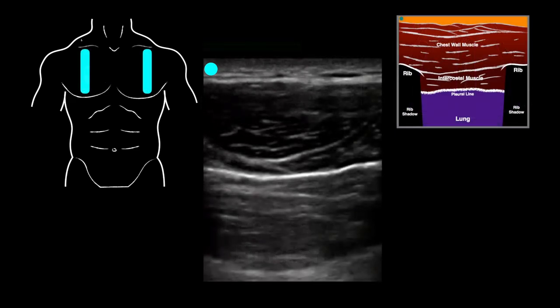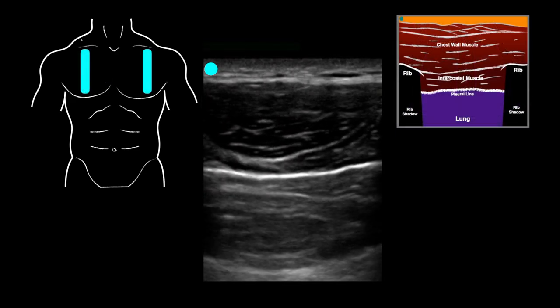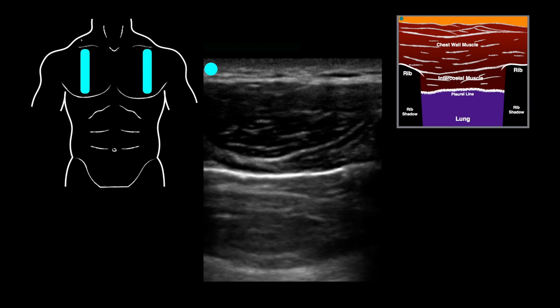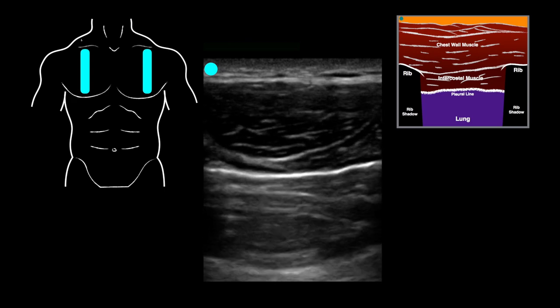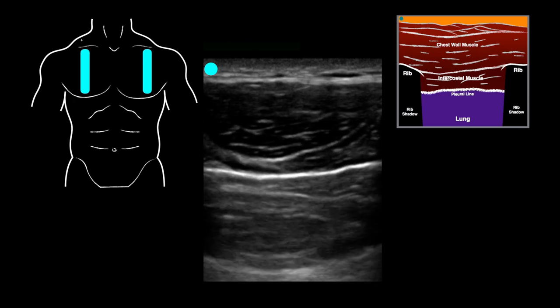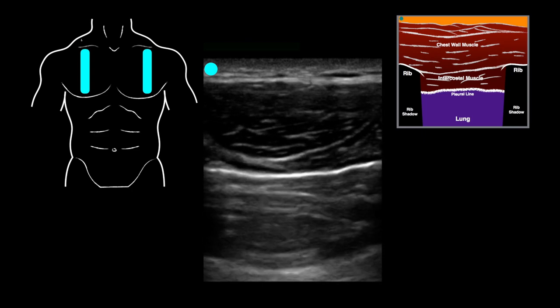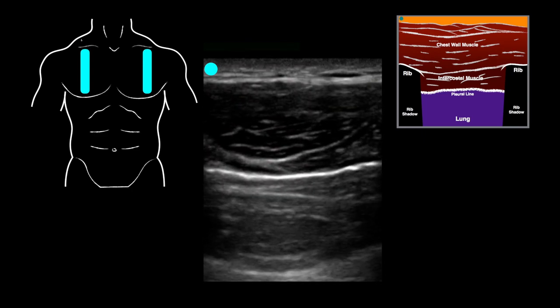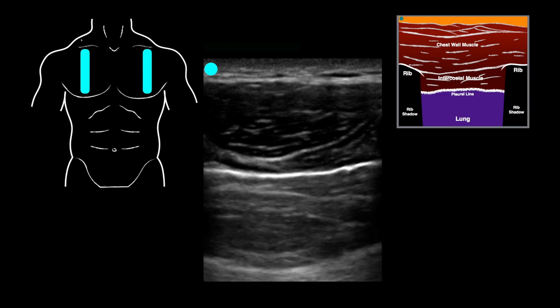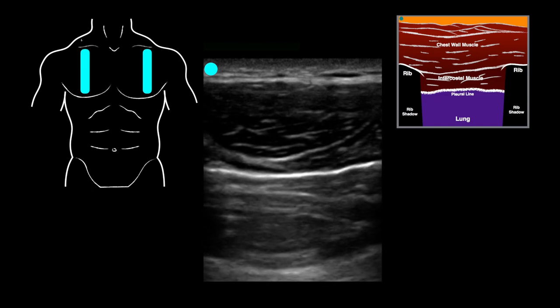If you still have difficulty telling whether lung sliding is present, you can switch to a linear probe — just as with the cardiac view, you could switch probes and evaluate for lung sliding. This will be a little more sensitive, and I'm less hesitant to switch to this probe at this point because I've typically finished the rest of the exam by then.